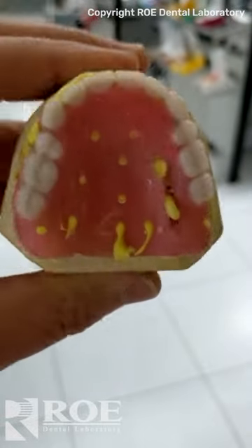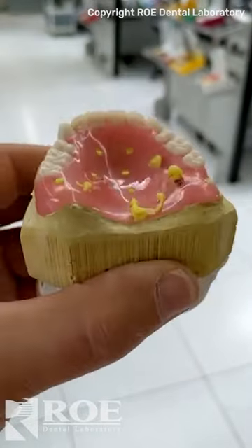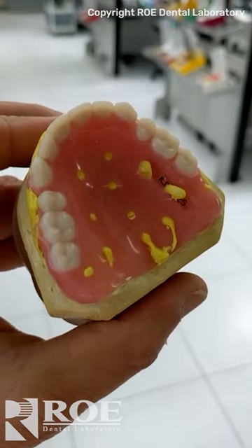Now that's slick. You send that back to us, this denture is going to have some really good suction. Nice technique.